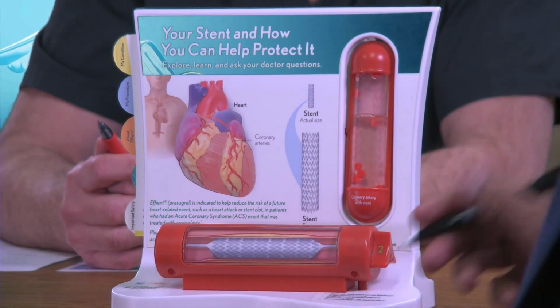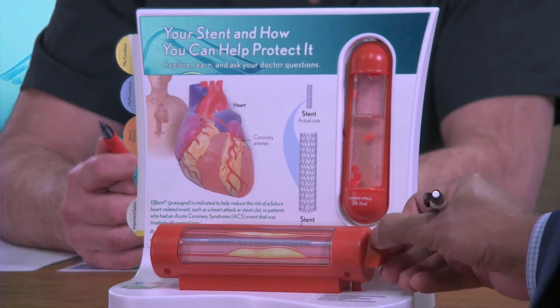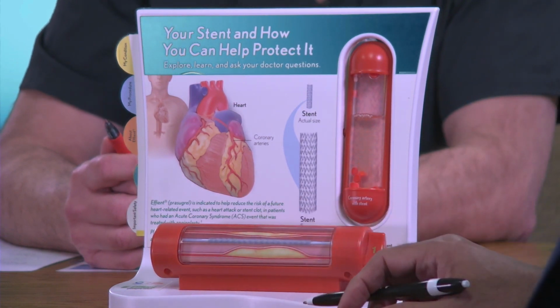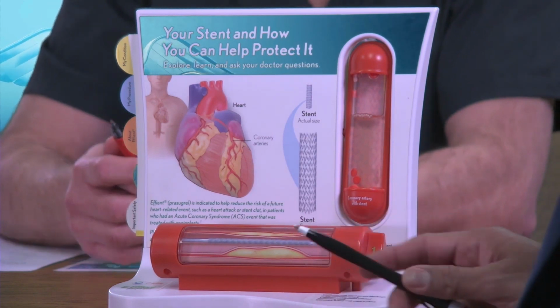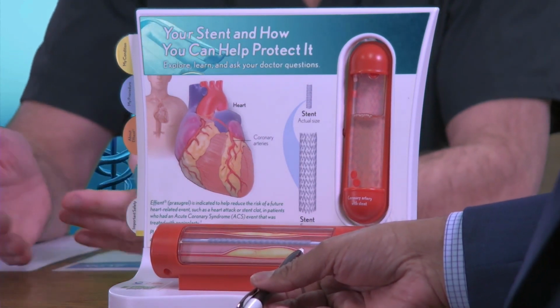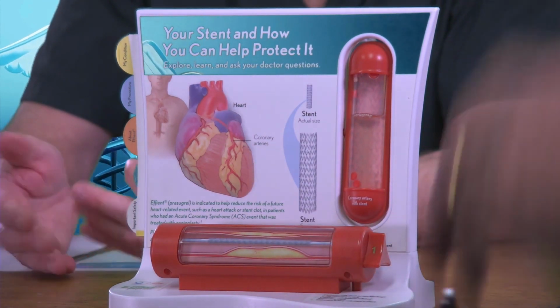Go back to the model at the bottom and go through it with us a little bit slower. So let me turn one more. Right? So this is where the cholesterol is. You're looking inside a cut open artery, and the yellow stuff is a cholesterol plaque that's blocking the flow of the artery. Yes. It's like stepping on a hose in your driveway. The water's not going to flow through, right?